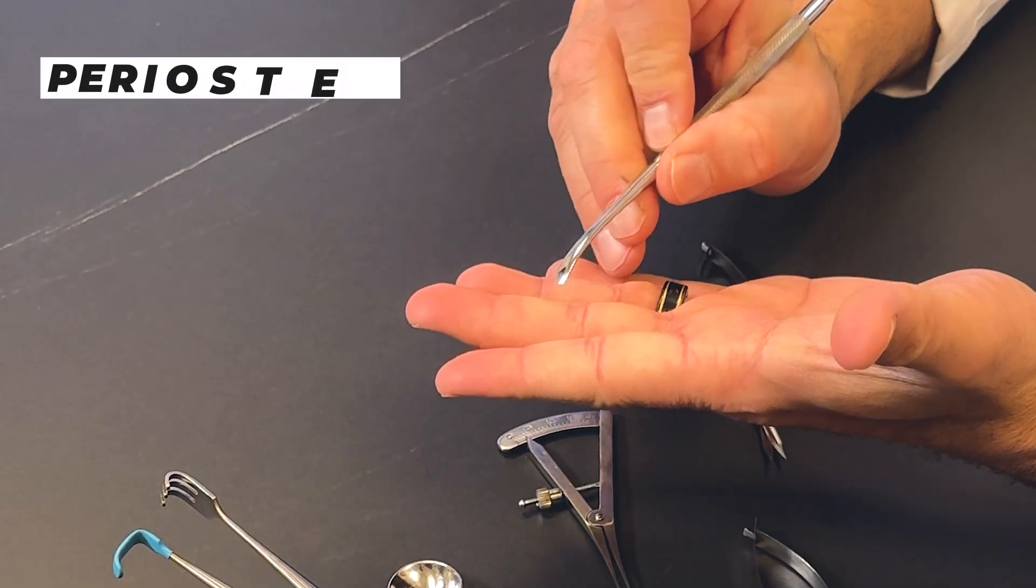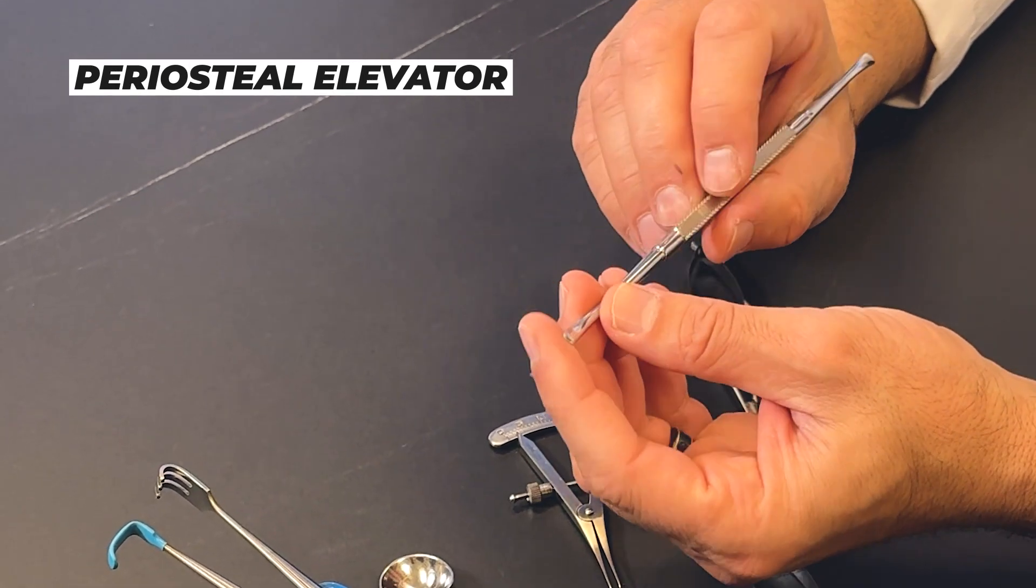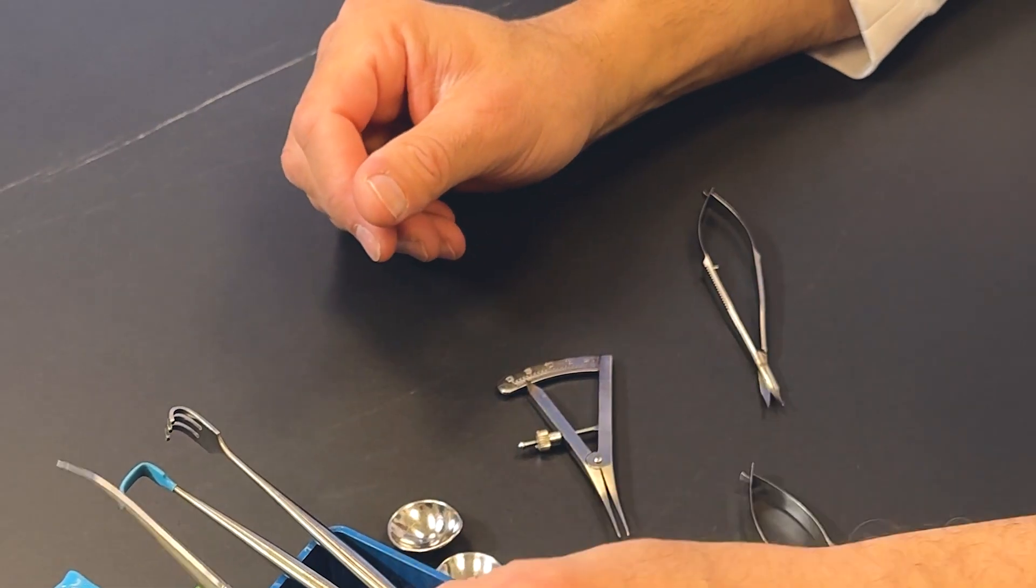It's a periosteal elevator. It really allows you to peel tissue off very carefully without damaging the underlying structures. I use this a lot in my fat repositioning procedures. In my lower lid, when I'm taking off the tissue above the bone, I actually use this elevator to gently lift off the tissue in a subperiosteal plane.